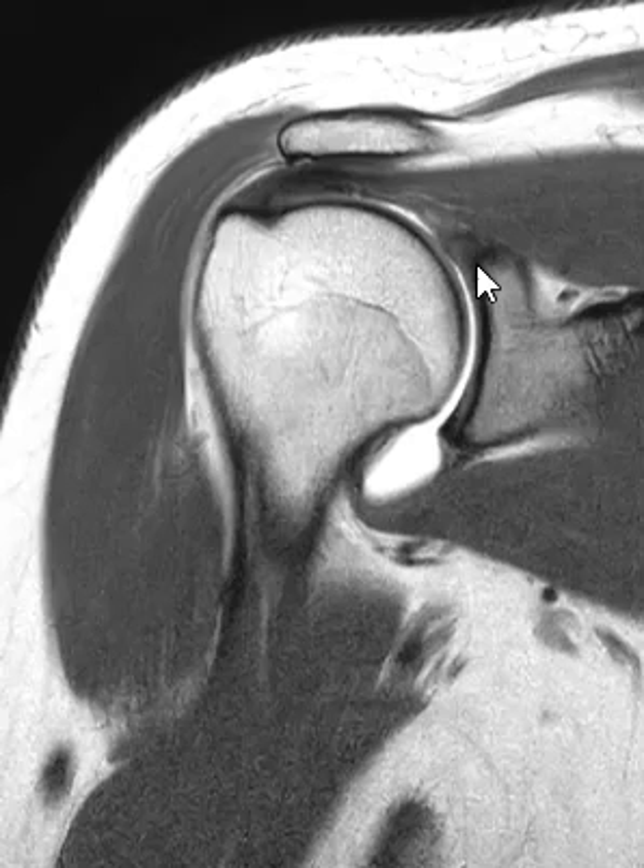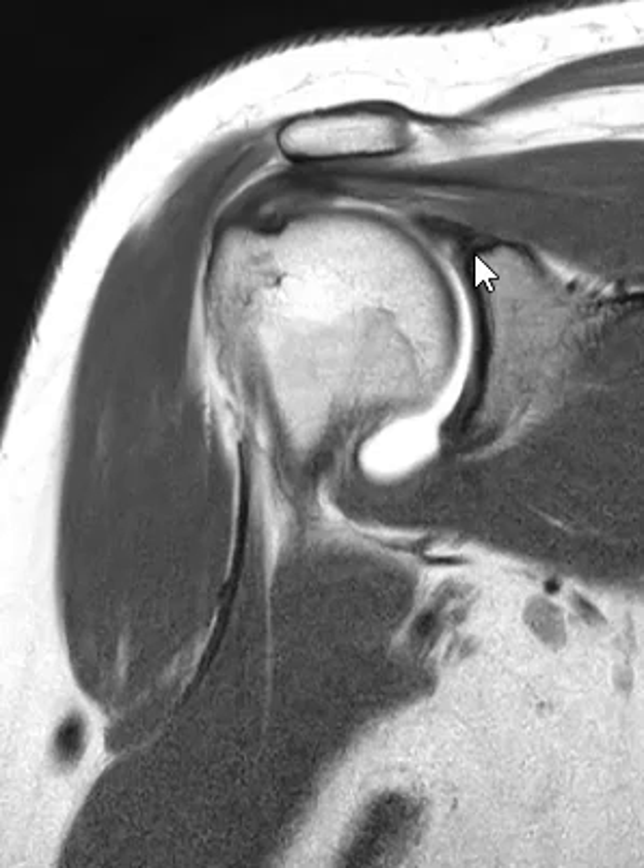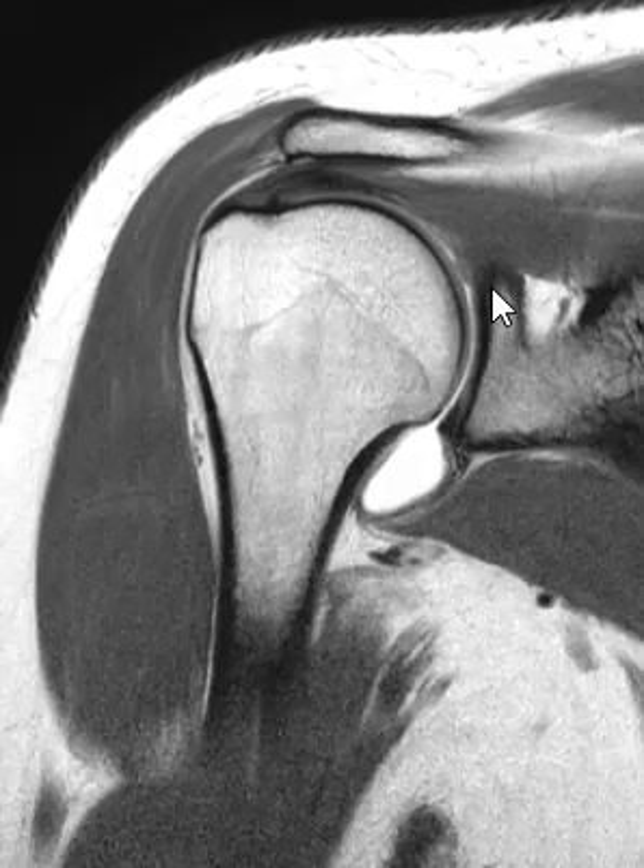It starts way up here — you wouldn't expect it to start so high. Usually when we think about the biceps, we think about it in the middle of the arm, but it's surprising that it starts way up here. This is the humeral head, this is the humeral shaft — the humeral head is the round ball here. We see a cup that sits in here called the glenoid, which is part of the scapula, and right along the top of the scapula is where the biceps starts.